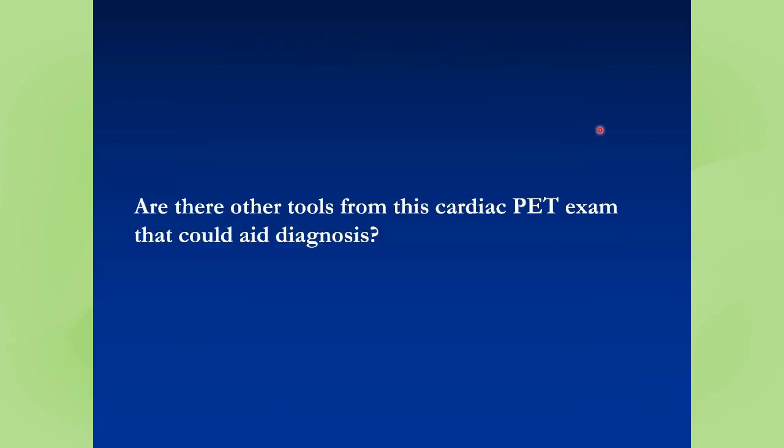And so the question is, are there other tools from this cardiac PET exam that could aid in our diagnosis? We've already seen at least one tool that can be of additional assistance, which is the absolute flow. And we'll look at that in a second for this patient.